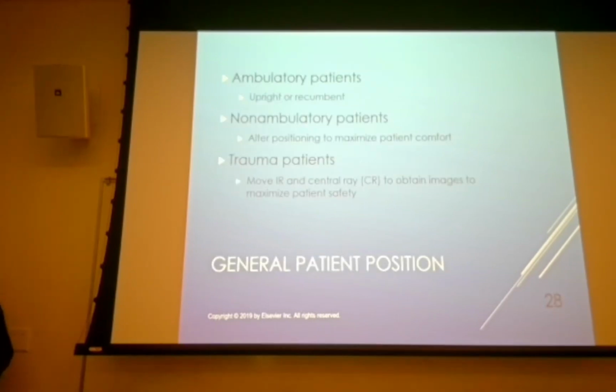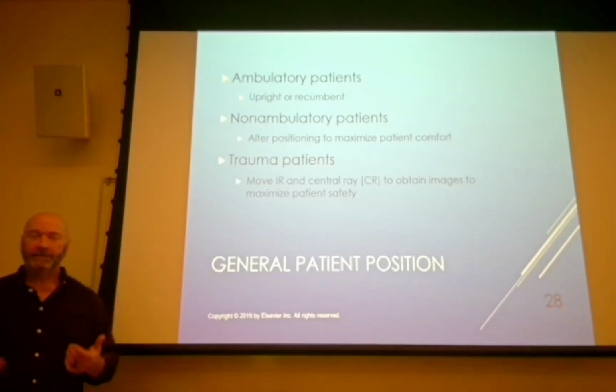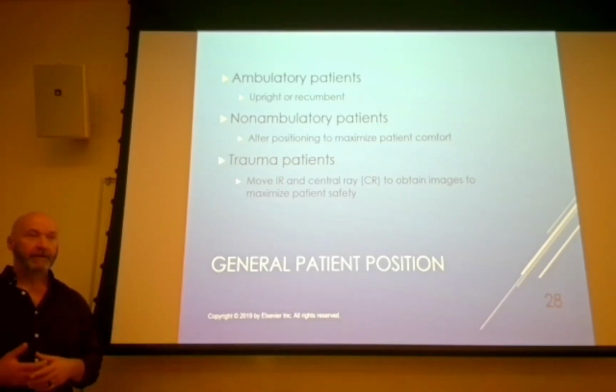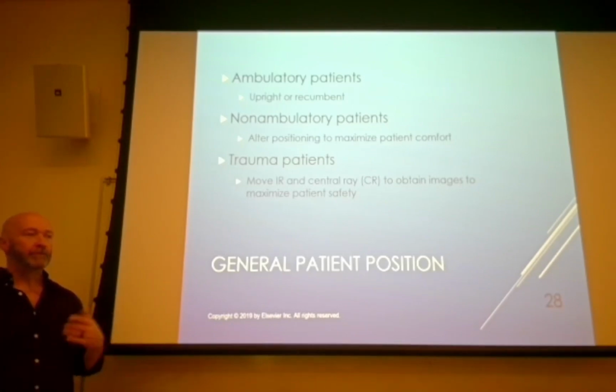So move the patient as little as possible. If you've ever had any kind of neck pain, it can be kind of positional. I don't think it's as bad in most cases as shoulder pain. I've had both, and shoulder pain, in my experience, is worse than neck pain as far as positionally goes. But move them as little as possible.